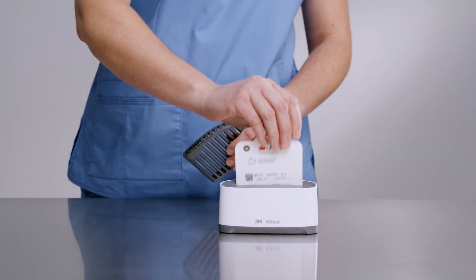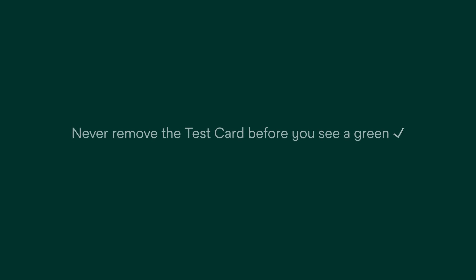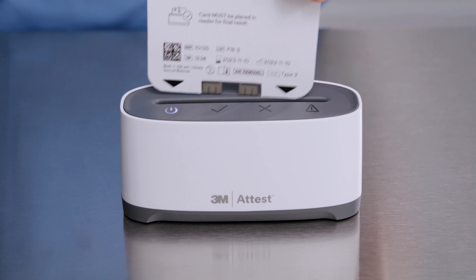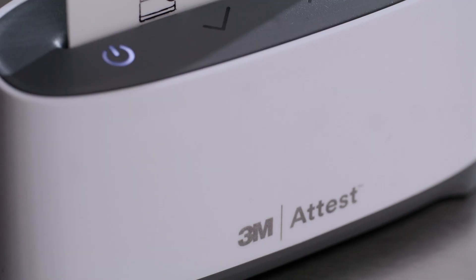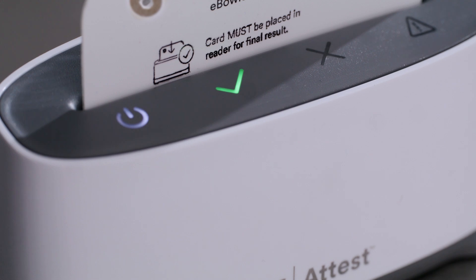Next, place the test card into the autoreader. In less than 5 seconds, a green check or red X sign will appear on the display when the test is complete. Never remove the test card before you see a green check or red X sign or the results will be invalid. The 3M ATest eBowieDIC autoreader 1190 is programmed to provide a result in less than 5 seconds of card insertion.